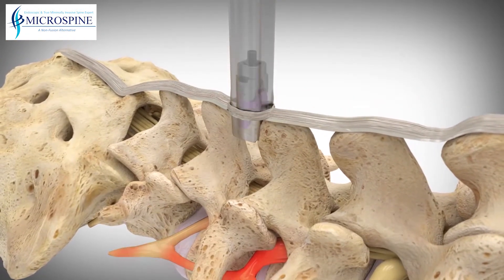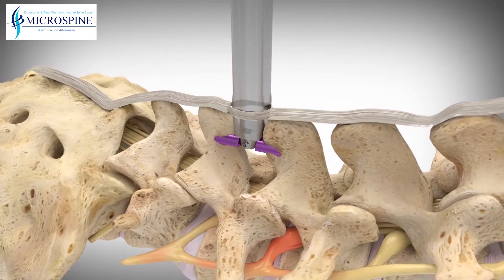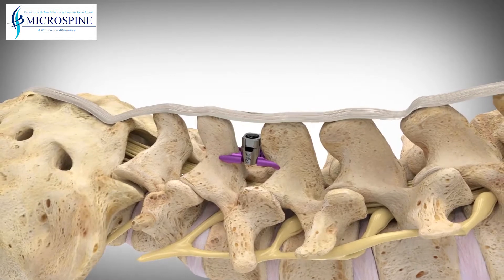When the Superion is placed, the device arms are opened and surround the spinous process. This helps in preventing the potential of the Superion from dislodgement.